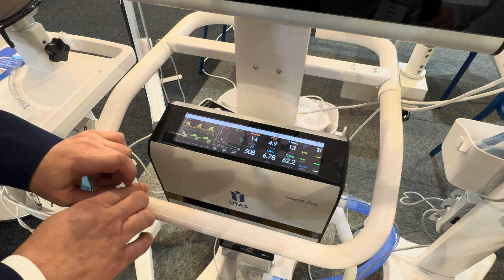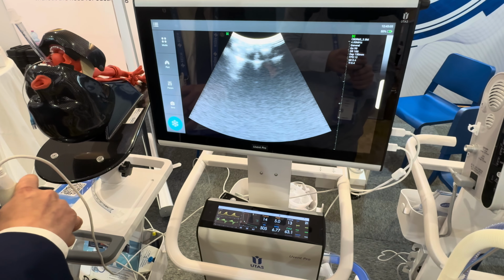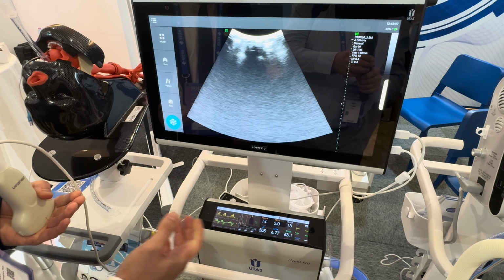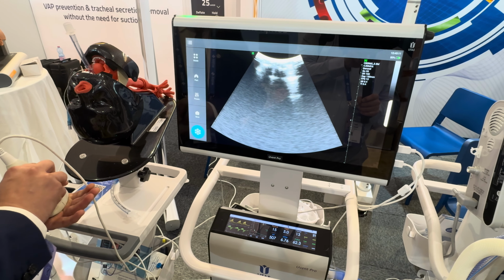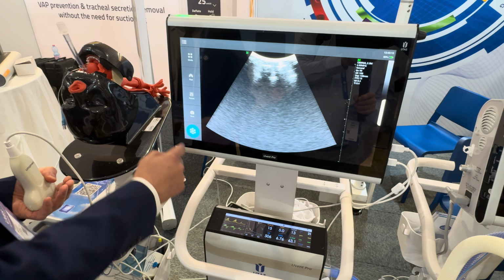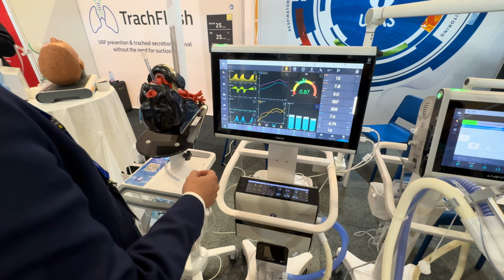The main point is that ventilation shouldn't be compromised if you're dealing with something else. Therefore, stay informed about the ventilation process while you're dealing with other diagnostic procedures, like point of care ultrasound, and then go back to the ventilation as well.